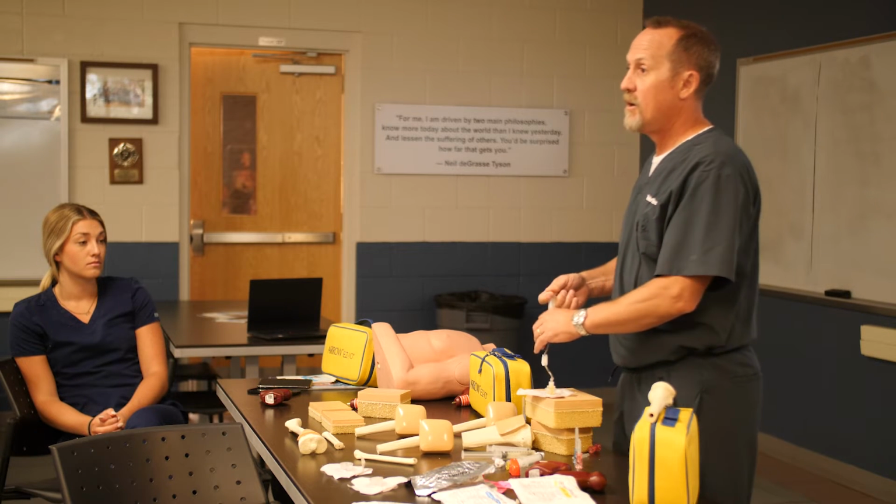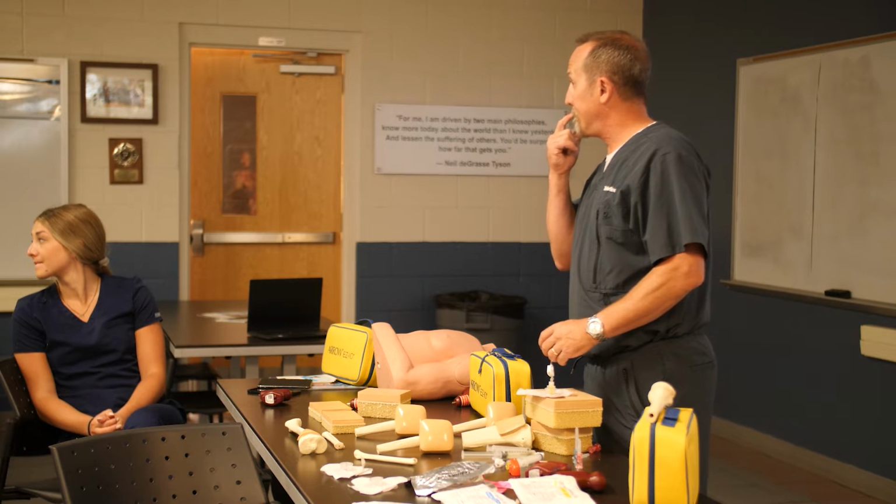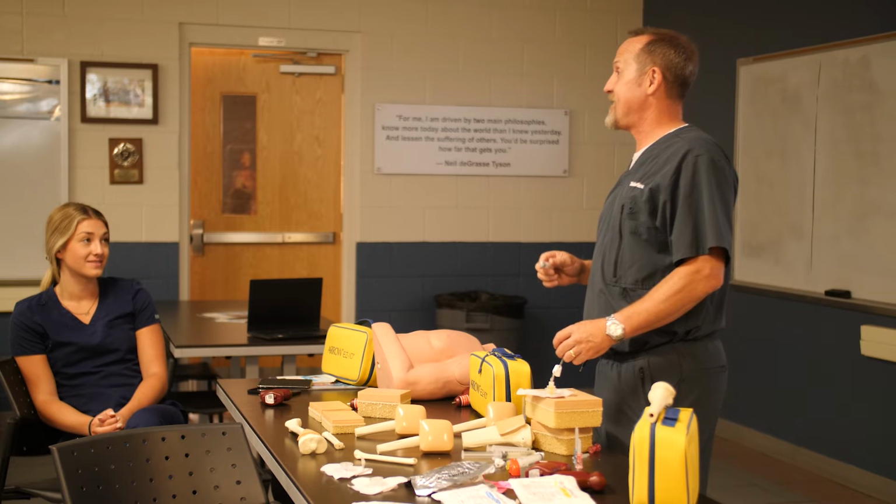Any questions on that? Once we've done that rapid flush, just so they know, that hurts. Yep, and I'll jump into that here in just a second.